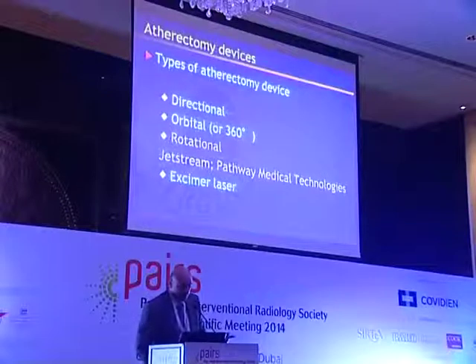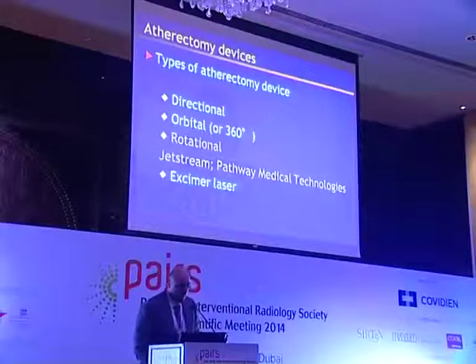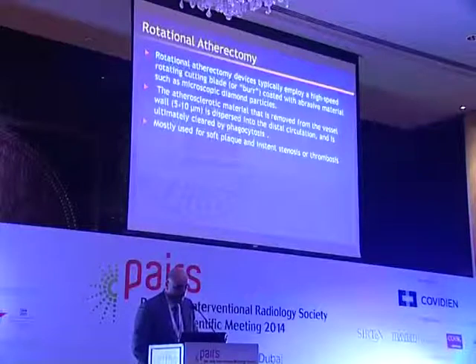The other atherectomy device, the rotational one, is the Jetstream from Pathway. It basically rotates at high speed and has a cutting blade.